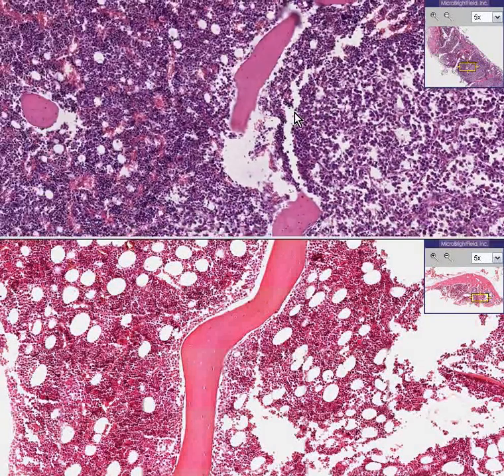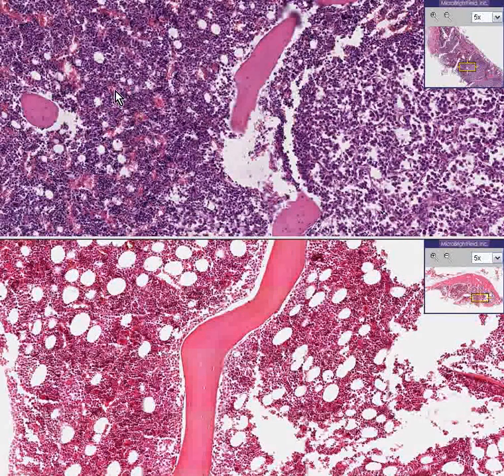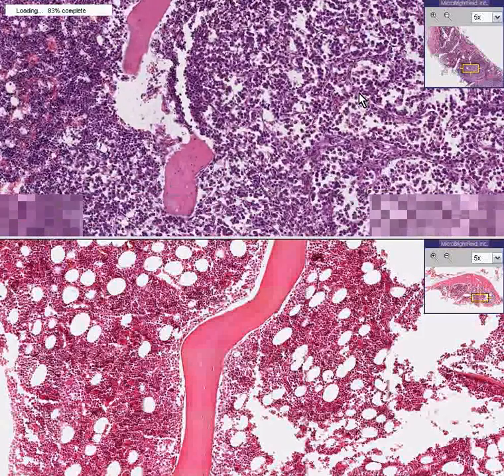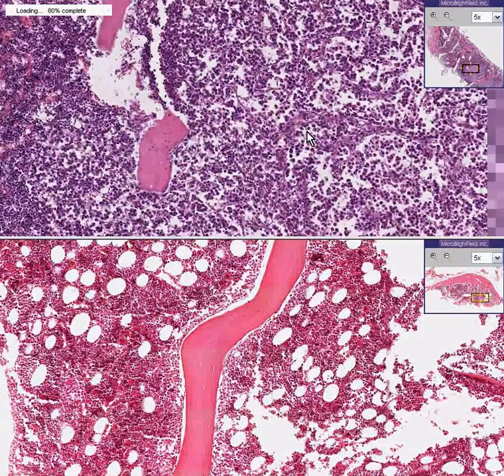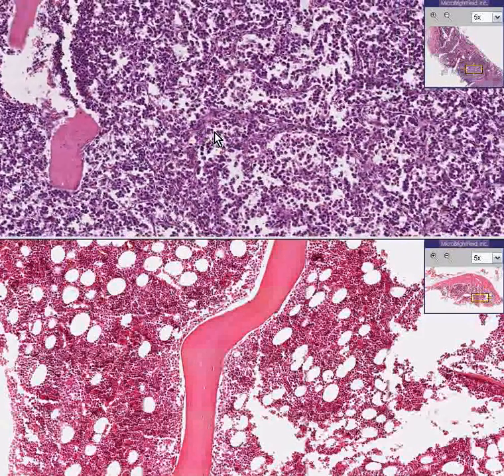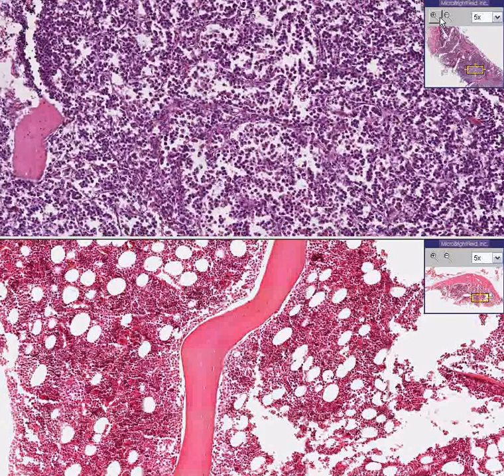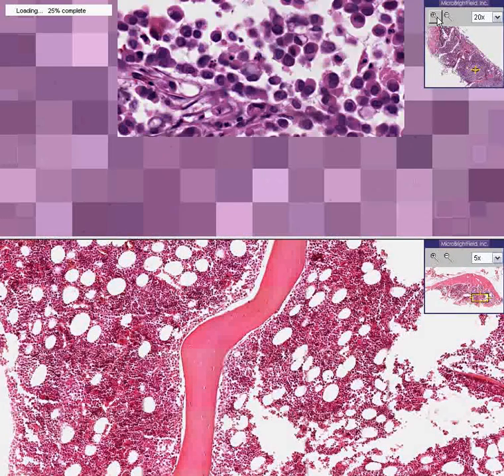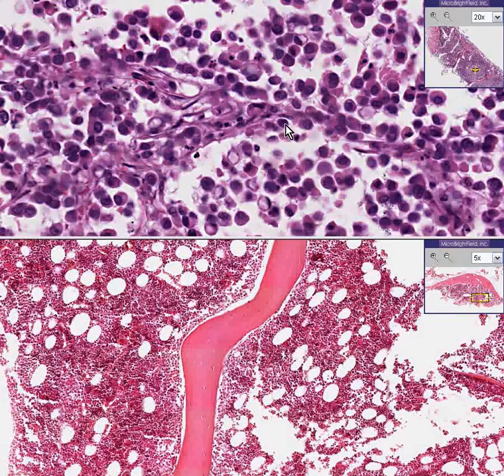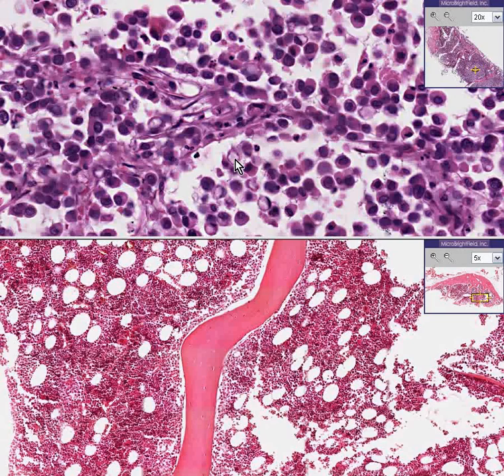There's an area here that doesn't look like the surrounding marrow. There are some spaces, but they don't really look like fat spaces. Let's zoom in on it and see what we can see. They don't look completely heterogeneous, and furthermore most of these cells look like they have vacuoles inside of them.